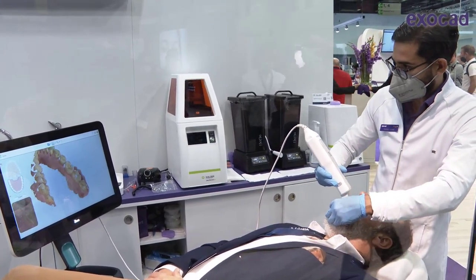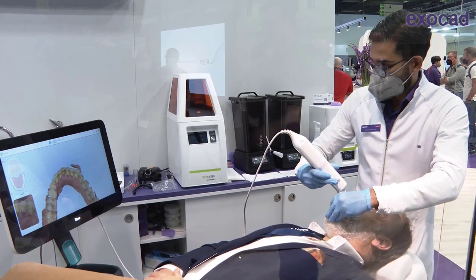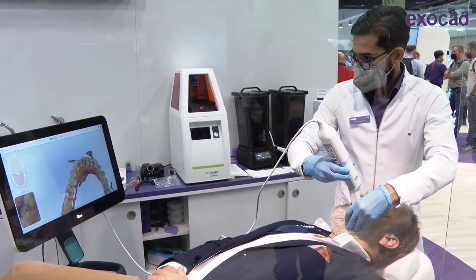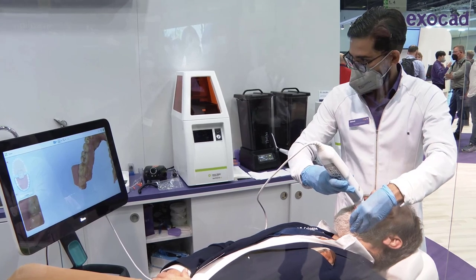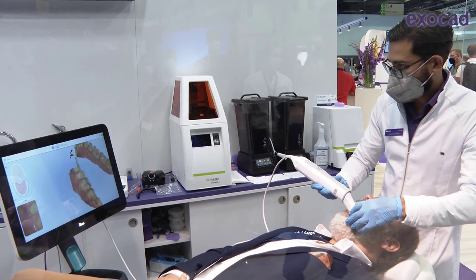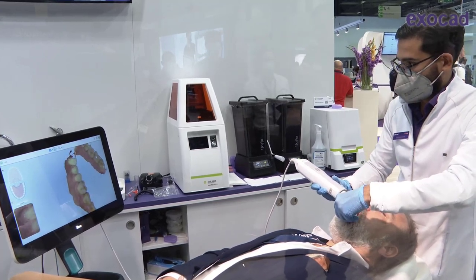About how long does it take to do a scan? With a bit of practice, you can do a full arch scan. At the Align booth here we have a little challenge — the record sits at 47 seconds for lower, upper, and bite. Realistically, you can do a full arch scan in about a minute to a minute and a half, and that's a very good scan without any missing surfaces.